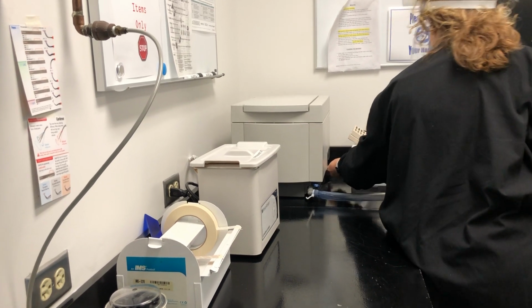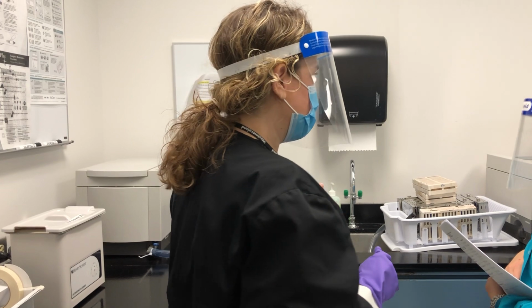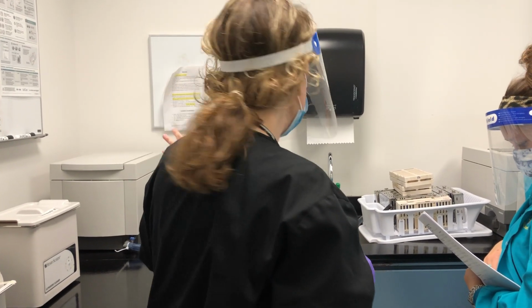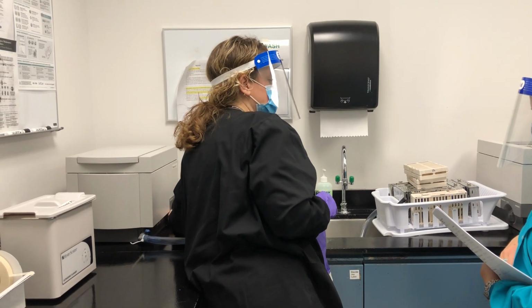There's a little knob over there, and then you can hear it start up. Does anybody have any questions about the Biosonic? Okay, so this is what it sounds like when it stops.